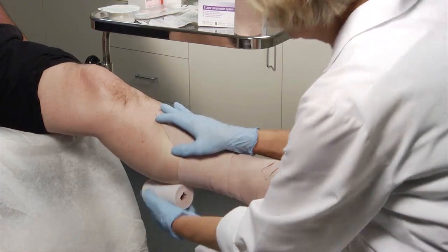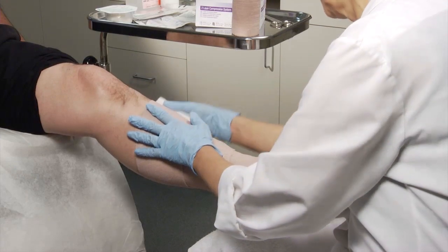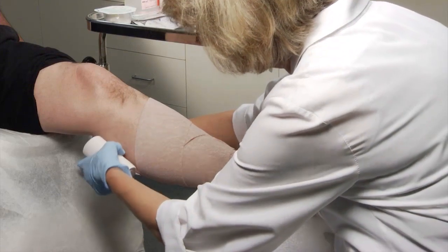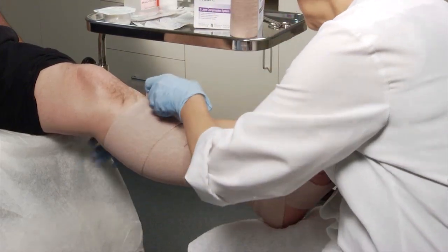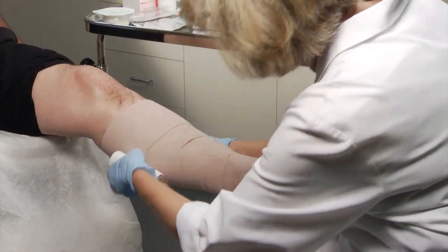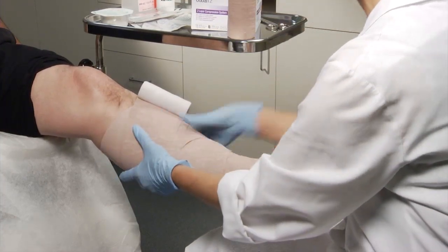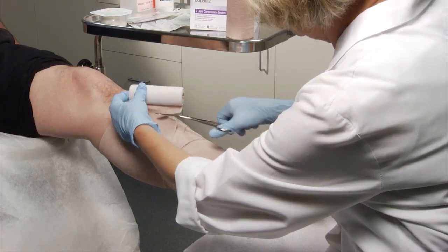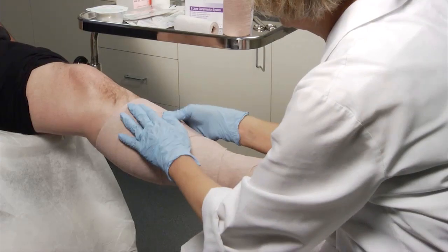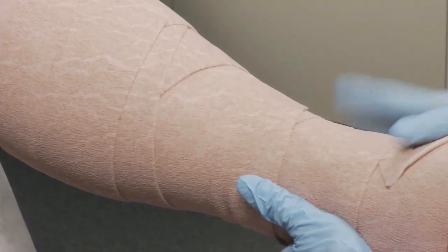The goal is to keep the applications thin for a low profile and to allow normal shoe options and comfortable ambulation. End the application just below the fibular head, or two fingers width below the crease at the back of the knee. As you end the application, apply light pressure and cut off the excess material. Mould the layers together to ensure that the bandage windings cohere to each other. There's no need for tape to secure the end.